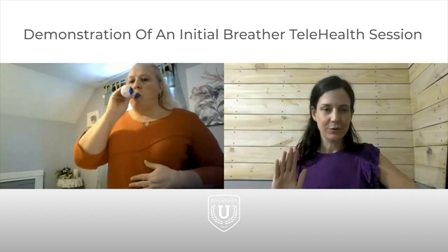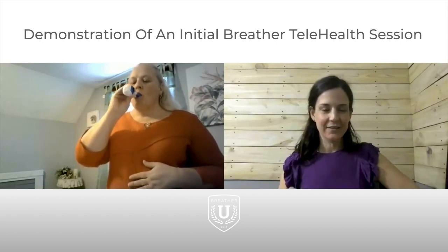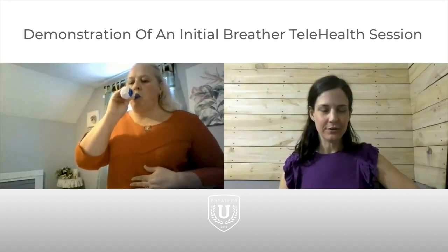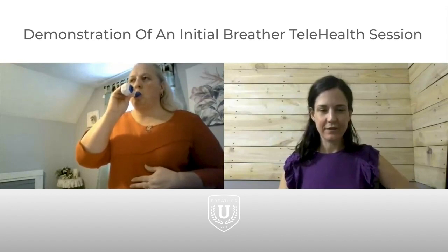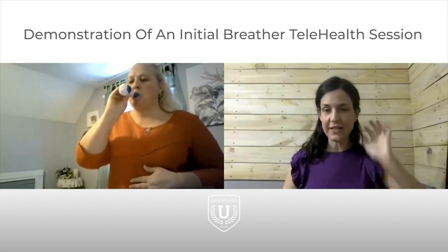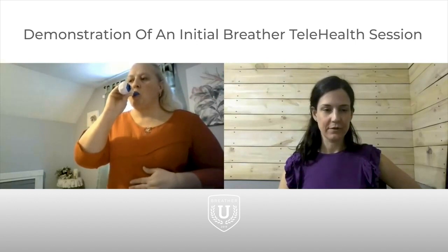And out. There's one. And blow it all out. 2. Beautiful. 1. Now. 3. Good. Make sure you're using that diaphragm. Good. 5.